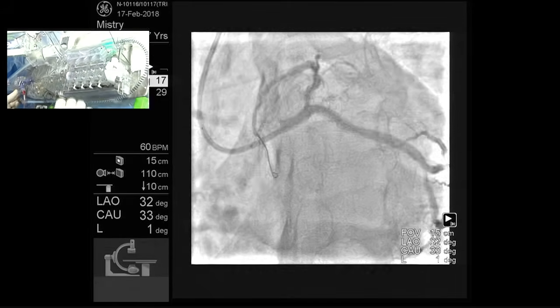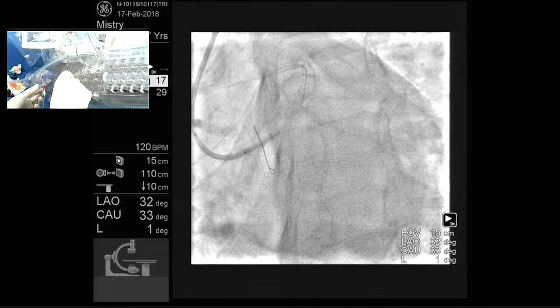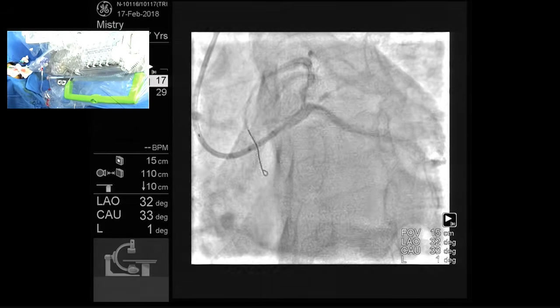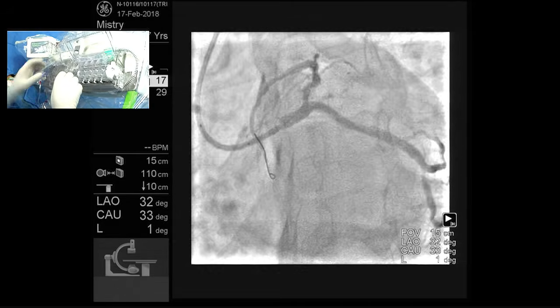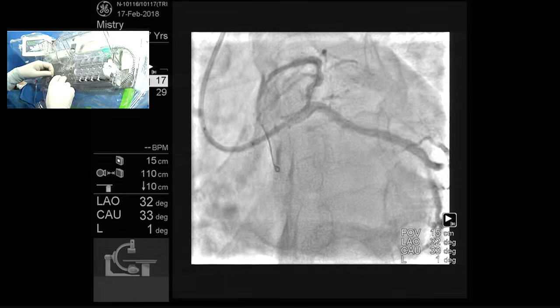What is the opinion from the audience? I think it will be at least 30 plus. What? At least 30 millimeter plus. No, diameter. 3 or 30. 3.0, 3.5 at the ostium diameter will overstretch. I think 3.5 is too much. But you put 3.0 in the mid, right?